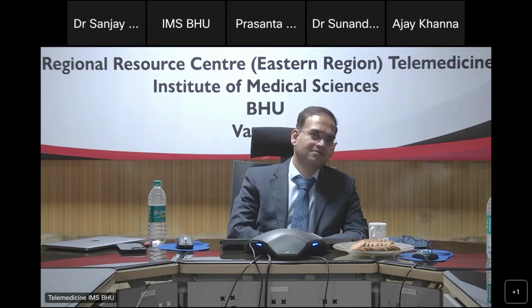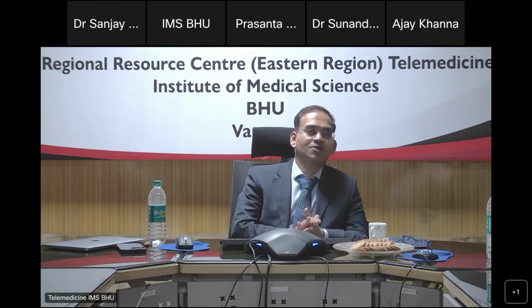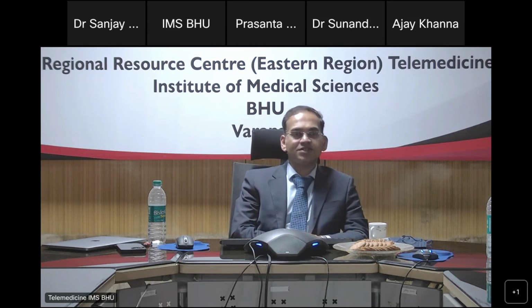The second question is, we discussed tuberculosis and other causes of aortoarteritis. So what is your take in the recent pandemic situation? Can COVID be an etiology, and a mass etiology? Okay, thank you so much for your question. Regarding your first question, when it comes to ultrasound, ultrasound is highly operator dependent.